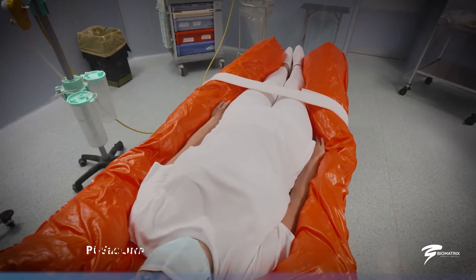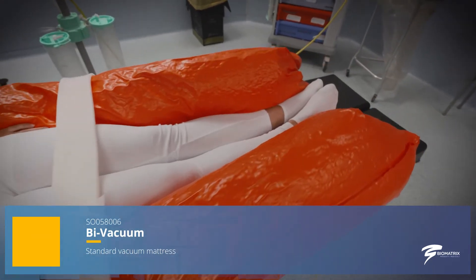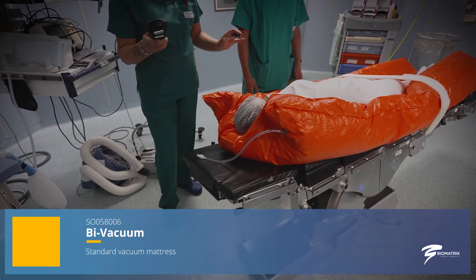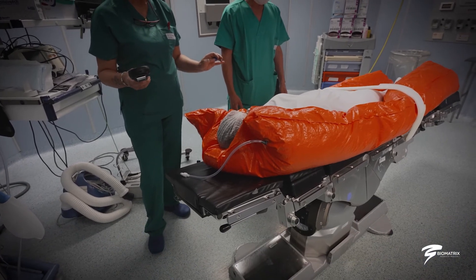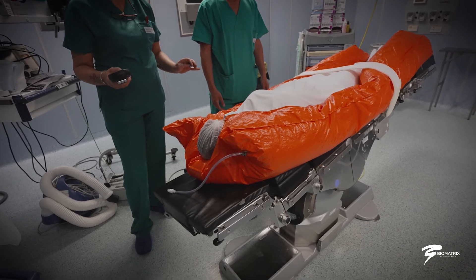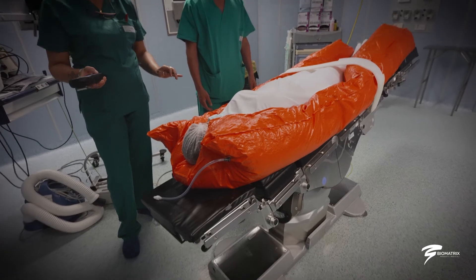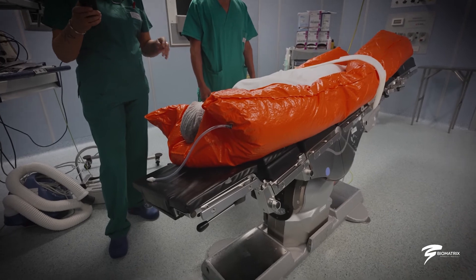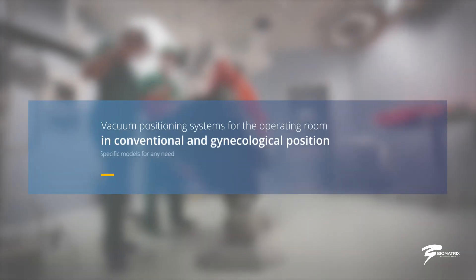Thanks to the B vacuum, the patient can be positioned exactly as the surgeon wishes for optimal preparation of the operating field. The B vacuum allows immobilization of the patient in positions difficult to reach with other systems, and allows maneuvering of the patient's legs and arms without having to reposition them. The B vacuum mattresses are available in various shapes and sizes to meet the needs of operators.